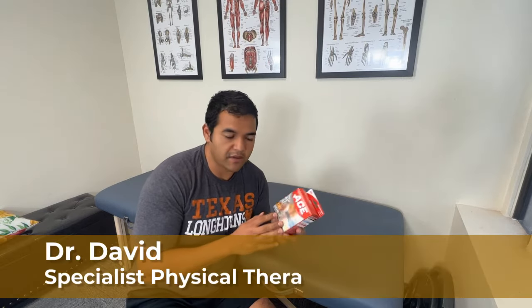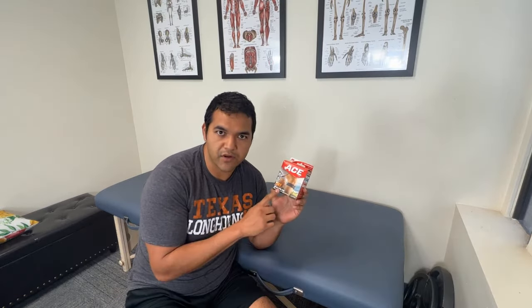Hey, in this video I'm going to give you my honest Physical Therapist review of the Ace Runner's Knee Strap.